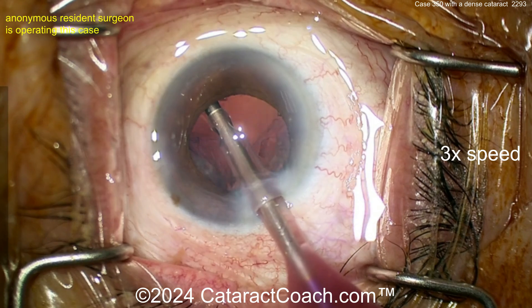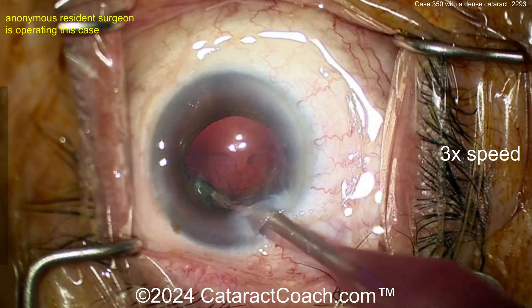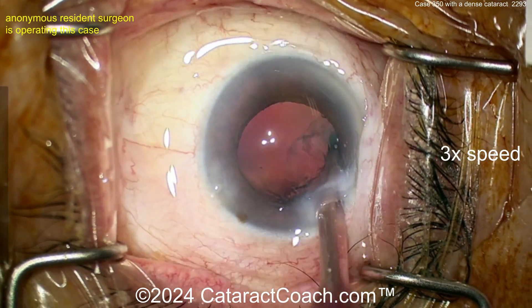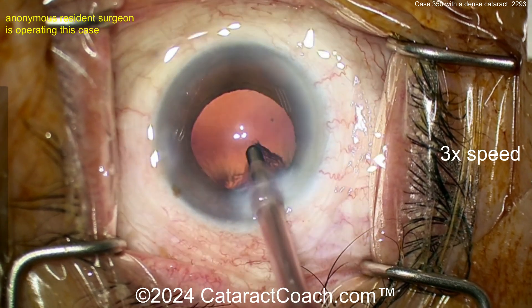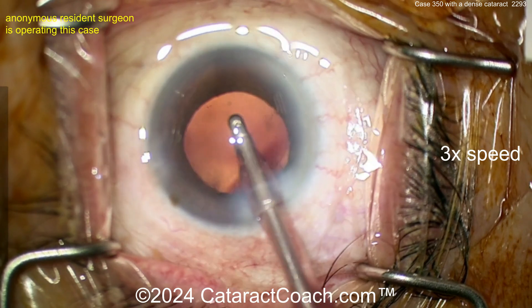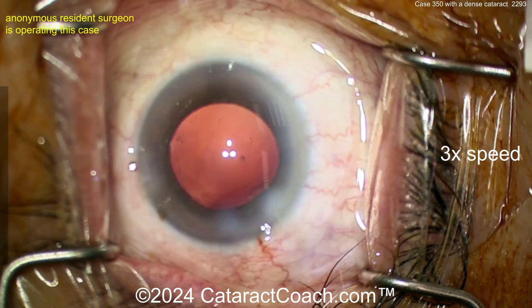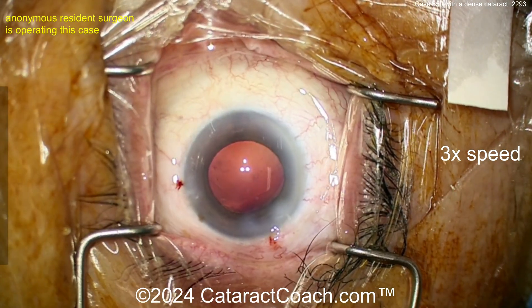Taking out the cortex with the coaxial I/A probe — that cleans up very nicely. Now we'll get that lens into the capsular bag. Just imagine how happy this patient is going to be — what an amazing difference, getting that dense brunescent cataract out of the eye. For case 350, I think you're doing a fantastic job. Tomorrow's video is for case 35 — a different surgeon with only one-tenth the experience — so we'll see the differences in surgical skill. Loading up the lens yourself — I like it, good job.